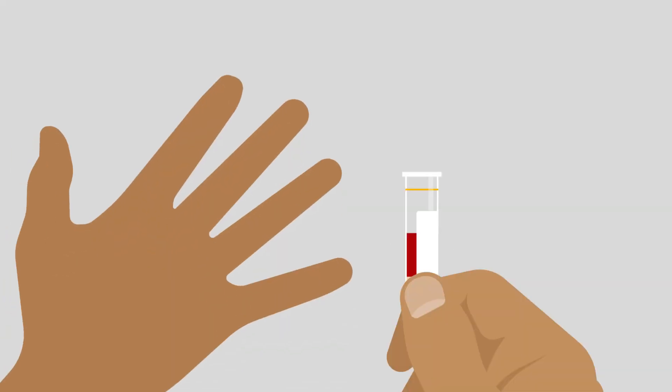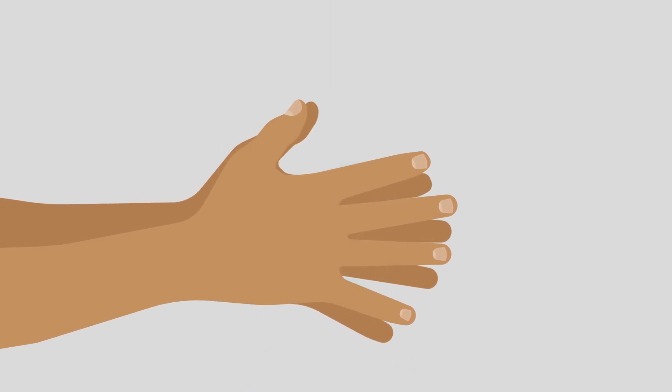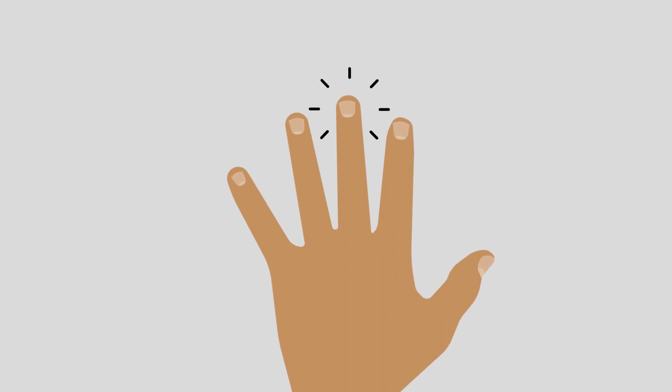If your first attempt doesn't work, don't worry. Start again from washing your hands and taking a few deep breaths. Rub your hands together to warm them up. Try this time using the middle finger of your non-writing hand.